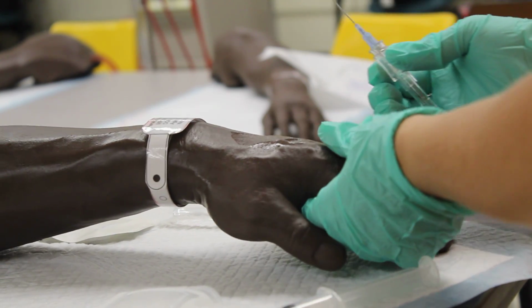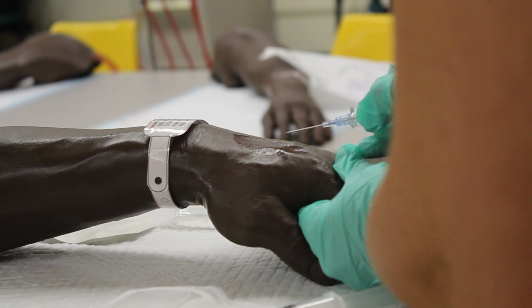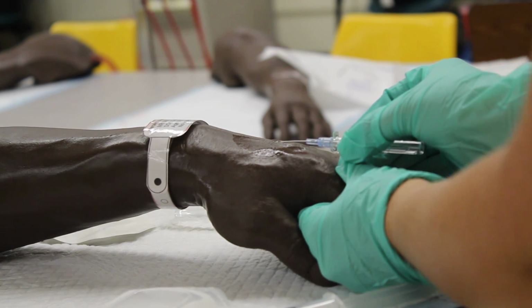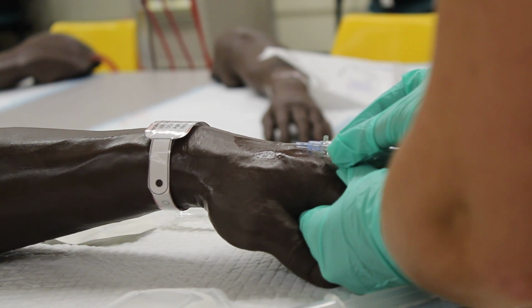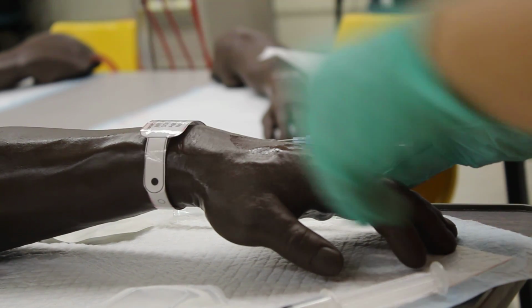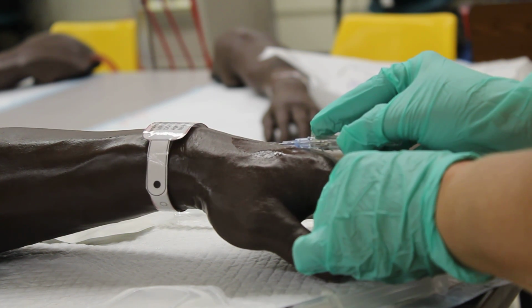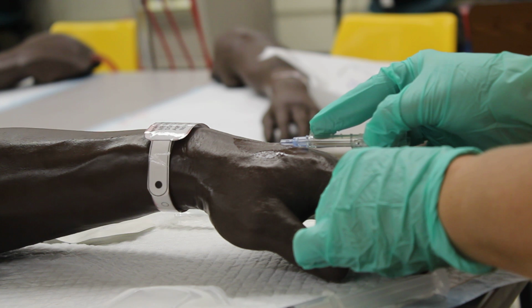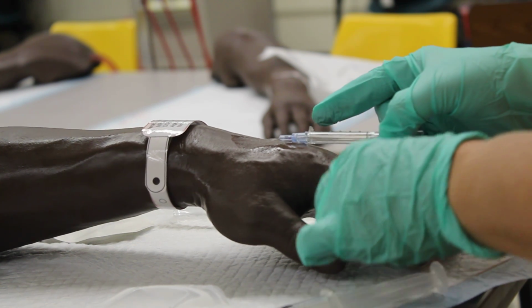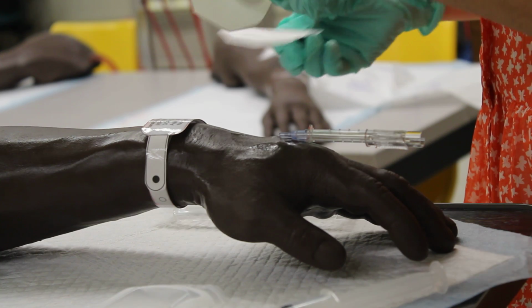So you're going to find where you want to start, apply counter pressure, and then once you actually get ready to insert, you puncture, guide it into your vein, wait for flashback. Once you get flashback, you want to pop your tourniquet, and then you want to guide the plastic part of the needle into the vein while pulling back the needle until it's all the way up to the hub. You click it into place, and then you steady that and watch it. Never take your eyes off that.